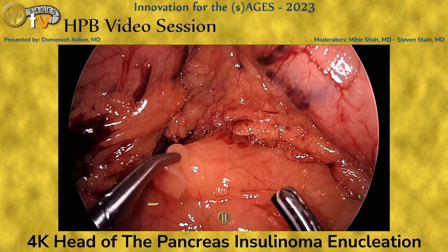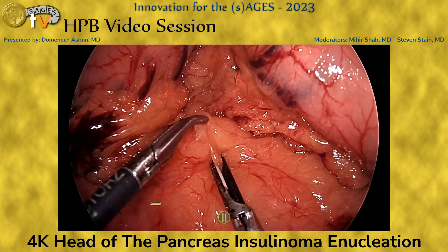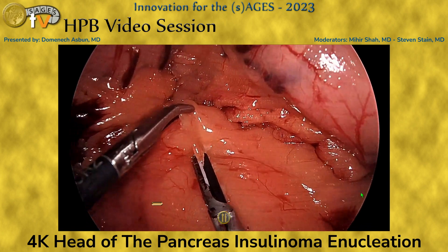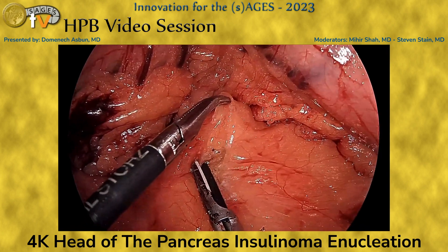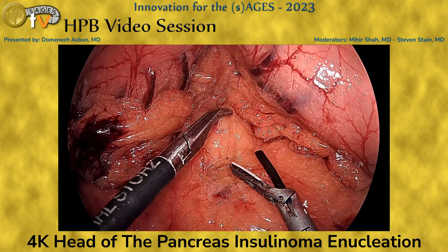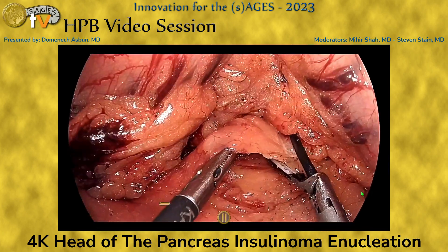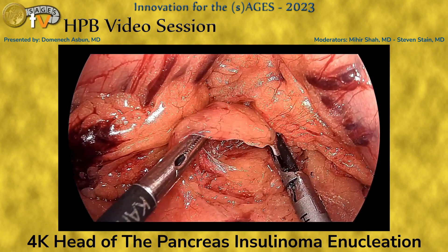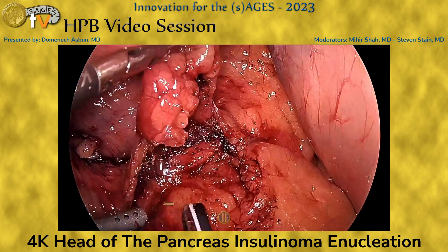We continue incising the peritoneum and mobilizing the peripancreatic fat as we start exposing this area. Because we were using the GDA as a landmark, we excise the anterior hepatic artery lymph node, identify the common hepatic artery, and then search for the GDA.